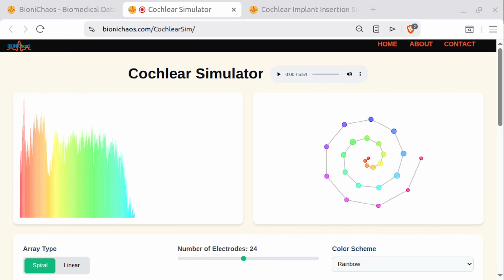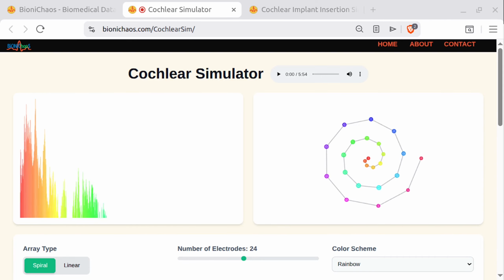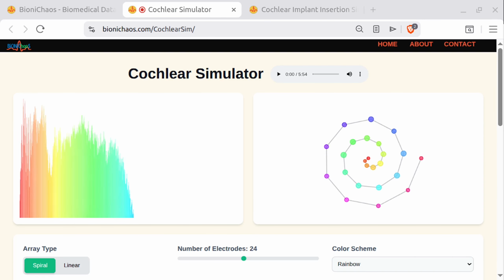It is incredibly difficult to untangle the surgical trauma from the underlying pathology that caused their deafness in the first place. I hear that. But honestly, whether the vertigo was triggered by the electrode fluid displacement or an underlying anatomical anomaly, the lived reality for the patient on a Tuesday morning is exactly the same. The floor is spinning and they cannot stand up. Fair point. The symptom is the symptom, regardless of the precise mechanical trigger.